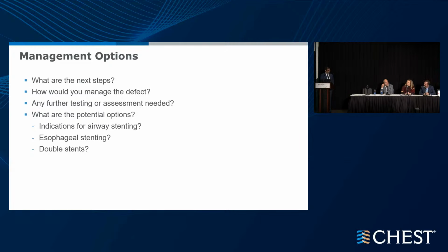Ooh. So custom stents right now in this country are only available in Y-shaped. I guess you can do that and put a lot of plastic to cover a hole that's about 5-6 millimeters. I would say any Y stent here would probably be an overkill. I think I would start with a fully covered, starting exactly from carina and going down the left, and then see what happens. By the way, for fistulas, fully covered are probably better than silicone because the radial force is much higher with silicone, so the hole can actually get bigger.